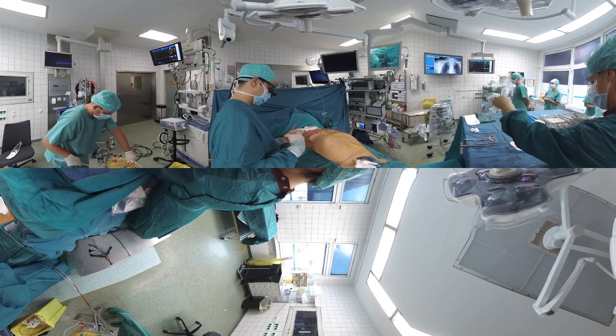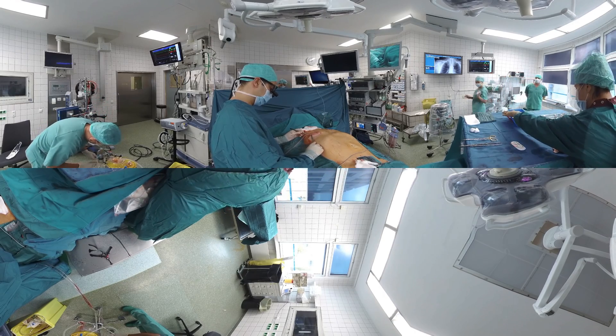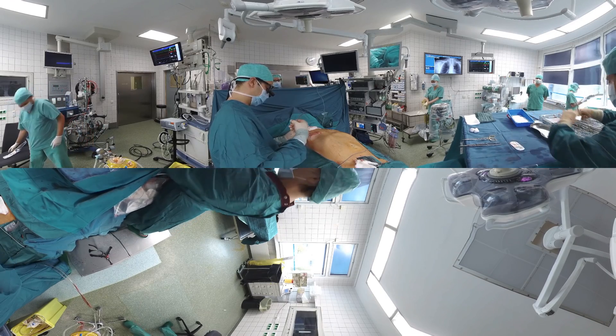The small incision is closed and the patient is then transferred to the recovery area. He will be transferred to the regular nursing ward tomorrow and discharged home on post-operative day six.